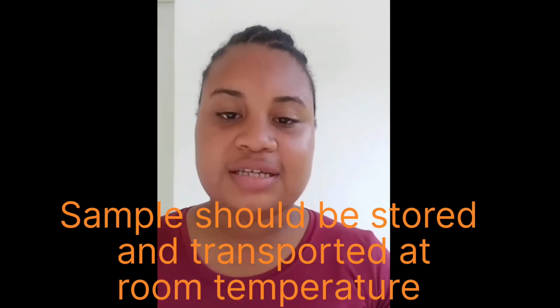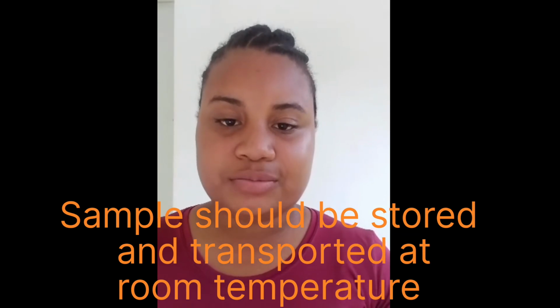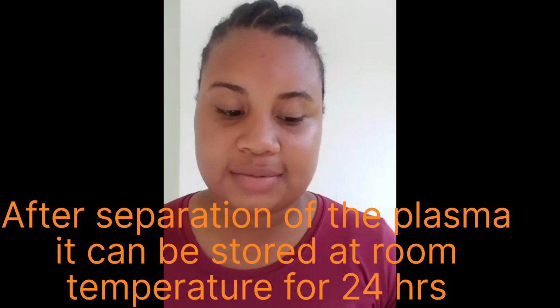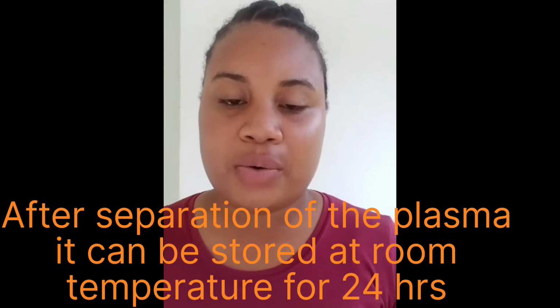After collection, the sample should be stored and transported at room temperature. If the sample exceeds 2 hours without being in the lab, the sample is then centrifuged for 15 minutes at 2000 g. After the separation, the plasma can be stored up to 24 hours at room temperature.